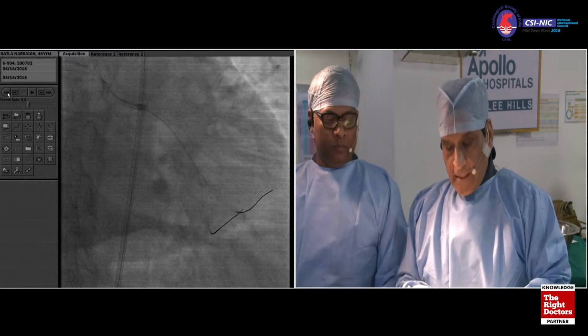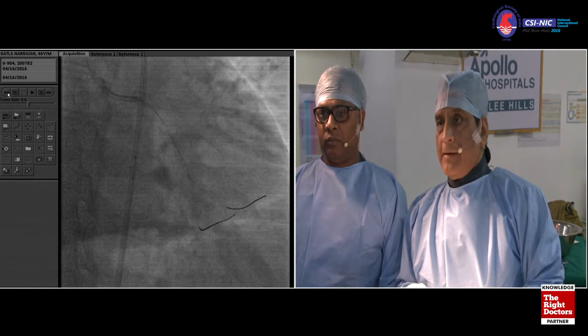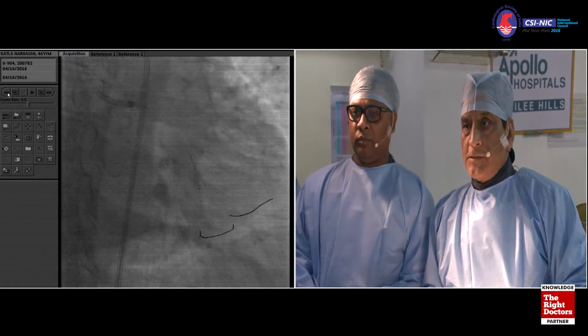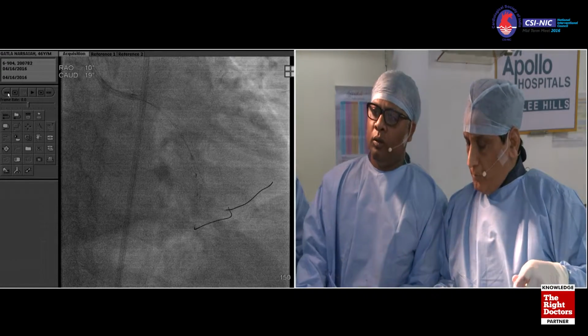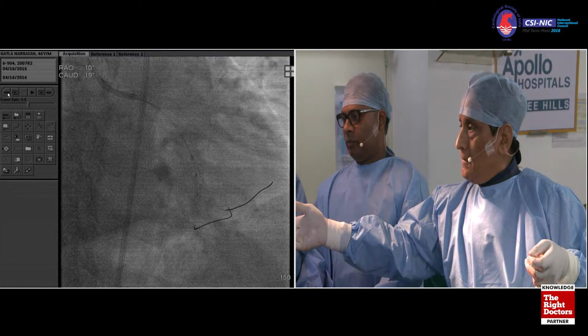And this one, clearly we are going to see some slow flow. Whatever we use in the lab here, back in the USA we would use verapamil or nitroprusside. So whichever way, we should have the medicines for slow flow. Get the second balloon. This is 2.5? It's a 2.5, 8 millimeter. So now you're doing the final kissing after this? Final kissing, yeah.